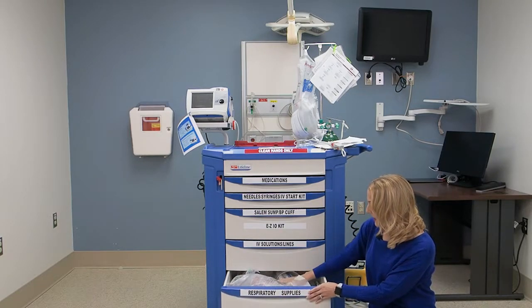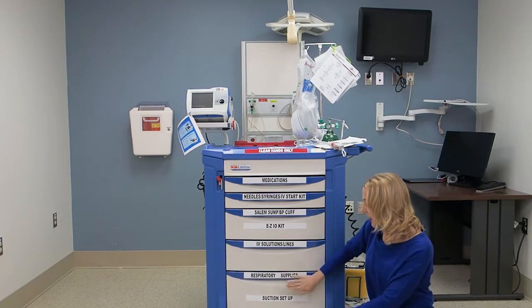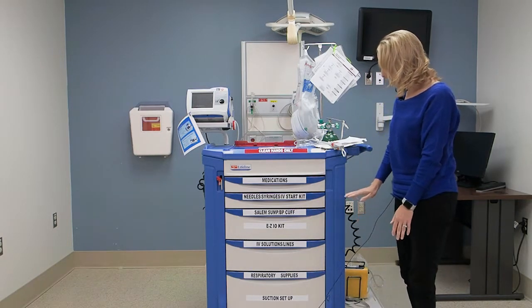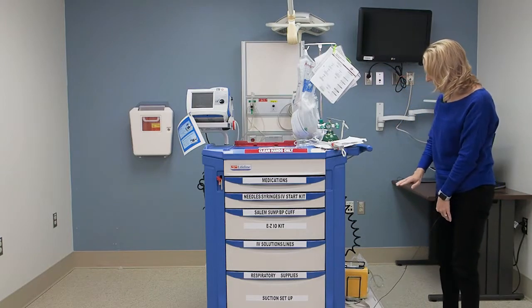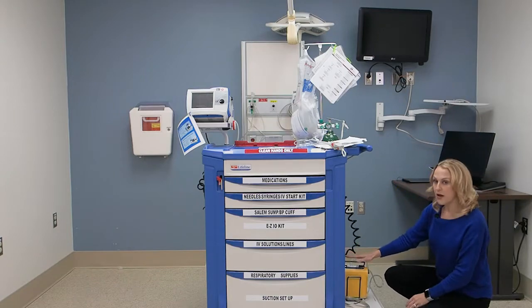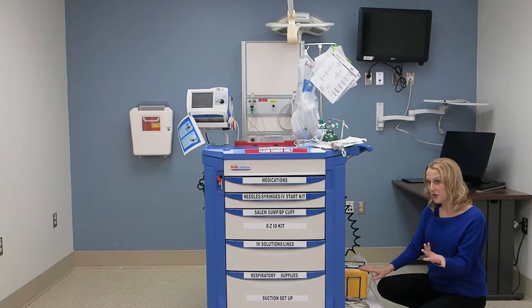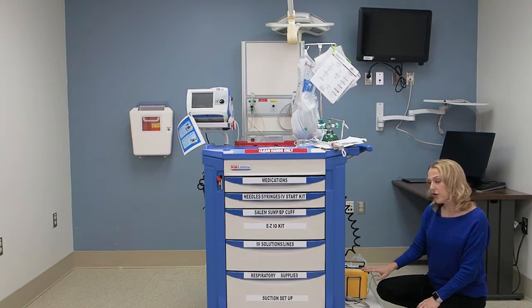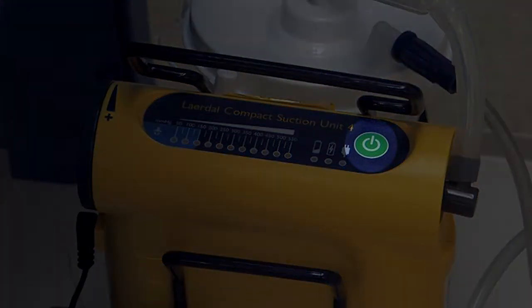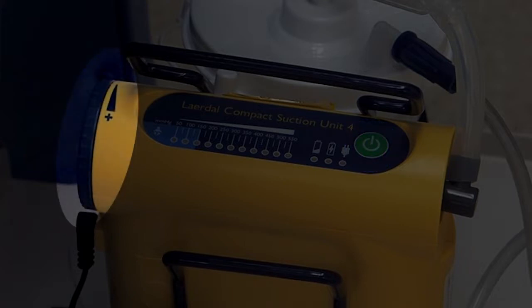So with that being said, talking about suction, we do have the availability to use the regulator for the wall suction, but on all of our crash carts, we have the portable suction. One of the important things about the portable suction is knowing how to turn it on, and then knowing how to increase or decrease the suction pressure. There is a green button which turns it on, and then on the side of the portable suction there is a plus sign.